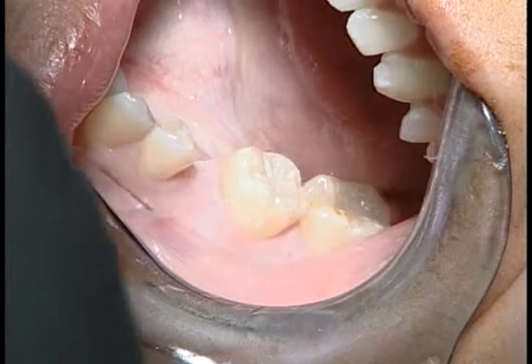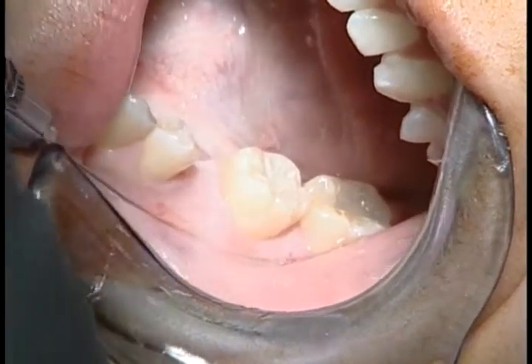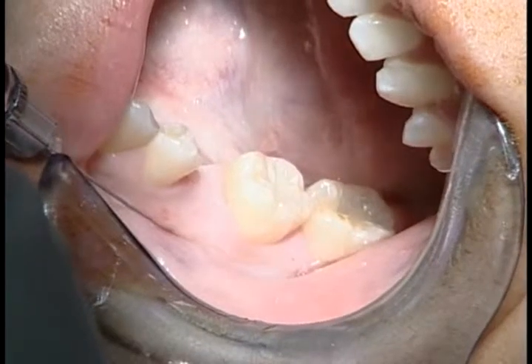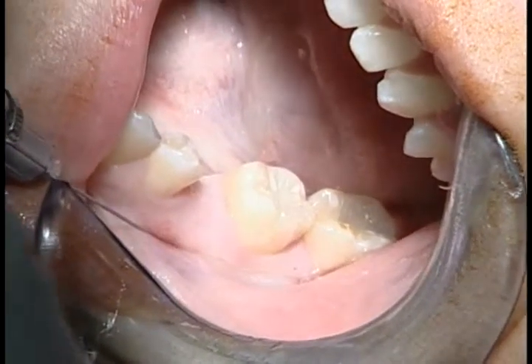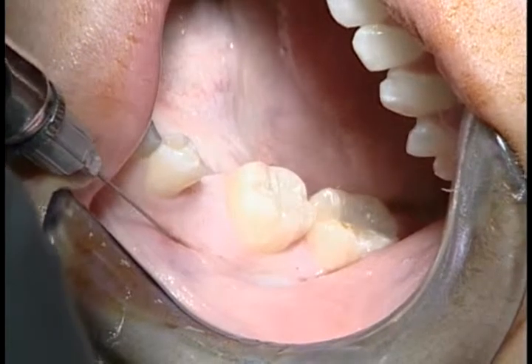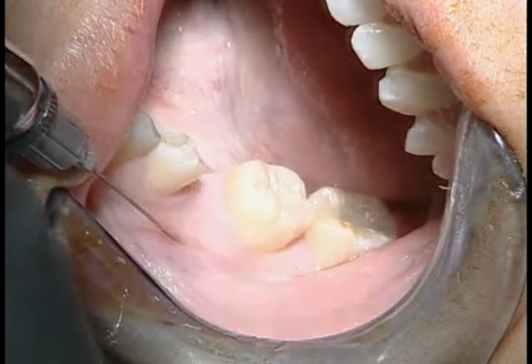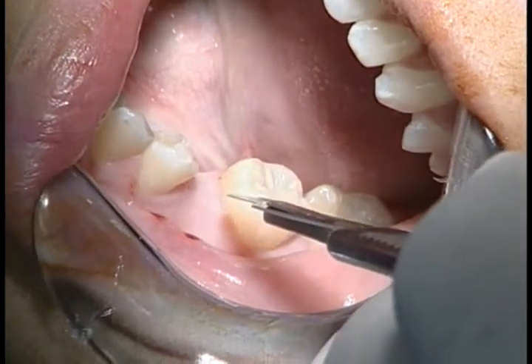The surgical site is anesthetized using a subperiosteal infiltration technique. A full carpule of anesthetic is placed on the buccal aspect and a full carpule on the lingual aspect. It's very important that the anesthetic be placed subperiosteally so that the surgeon can assure himself that the needle is against the hard tissue before depositing the anesthetic. The incision should be a full thickness incision.